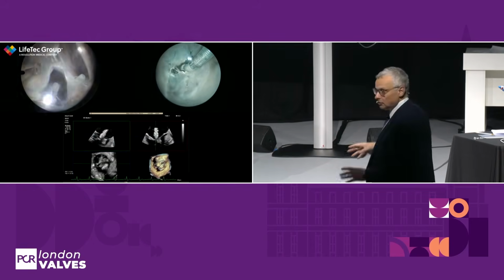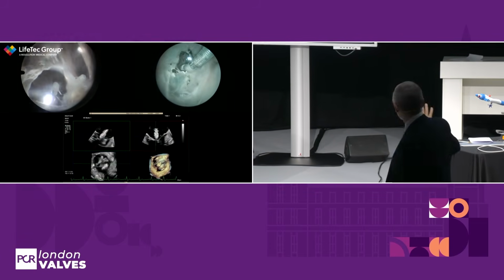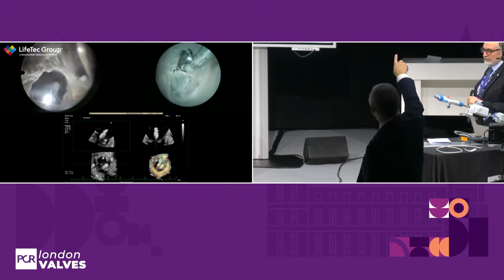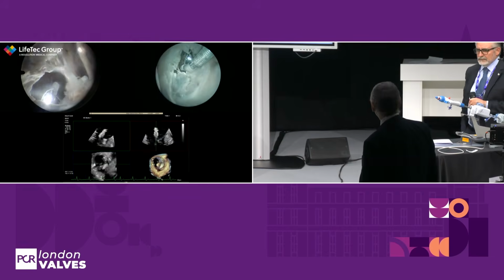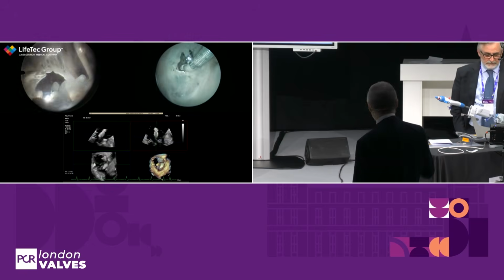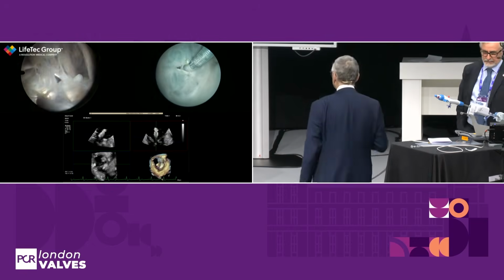First of all, Romitelli already implanted one clip, which you see there on the right side, very well. There is a clip between the septal and the anterior leaflet, and the clip has been implanted nicely in the middle of the leaflet. Yes, like the red clip.